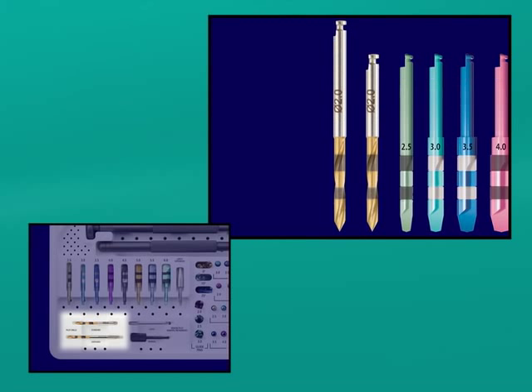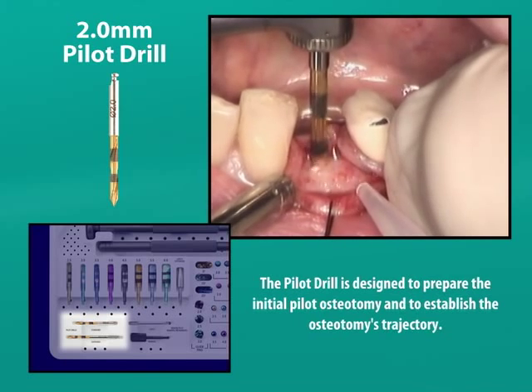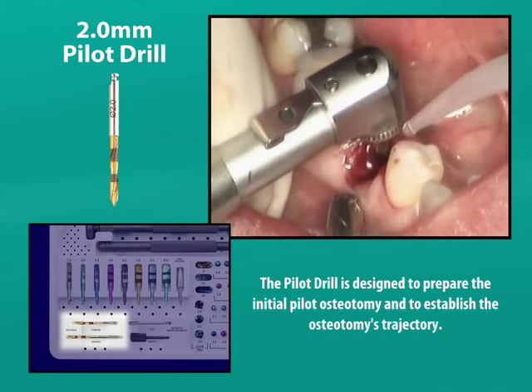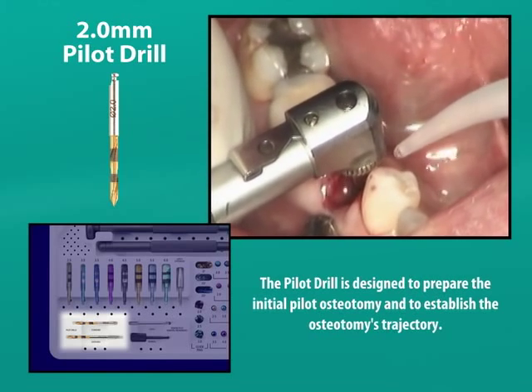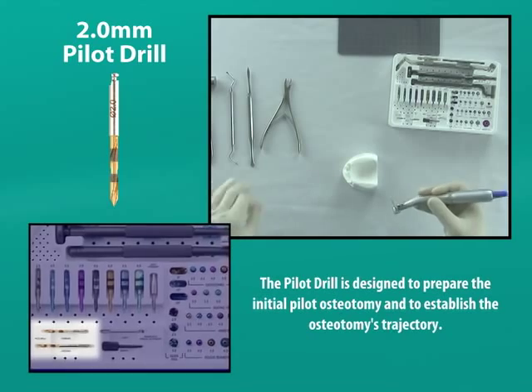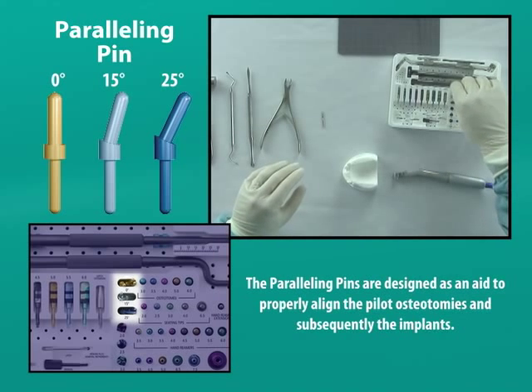Because the pilot drill rotates at 1100 revolutions per minute, it is important to have external irrigation to avoid thermal trauma to the bone. When using the pilot drill, we will use a smooth pumping action to facilitate the cooling and flushing actions of the irrigating fluid. Once the pilot osteotomy's location and angulation have been set, and before we continue with the reamers, we must confirm them with a paralleling pin.